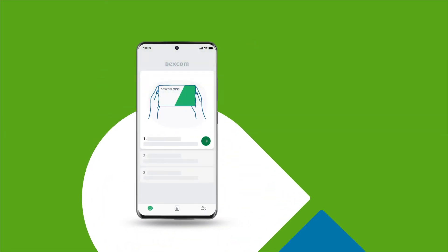Back to the app. After login, the app shows you an overview of how the Dexcom One works. Read these screens to learn everything you need to know about Dexcom One.